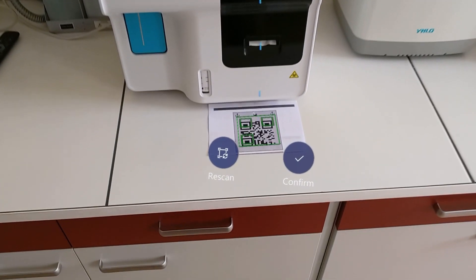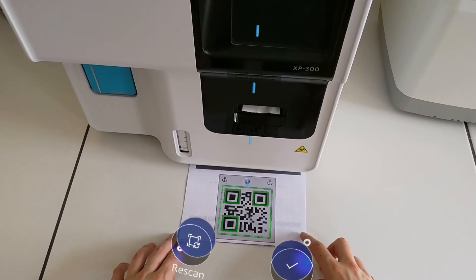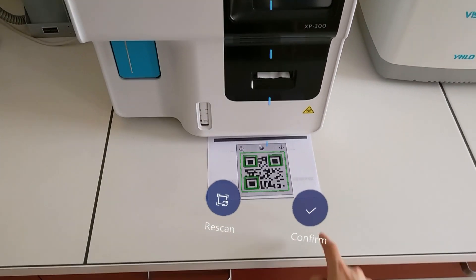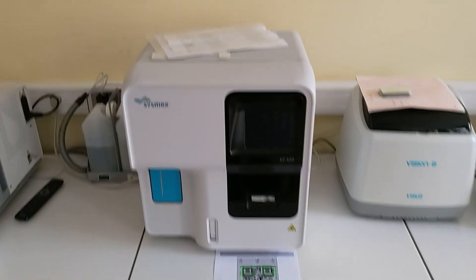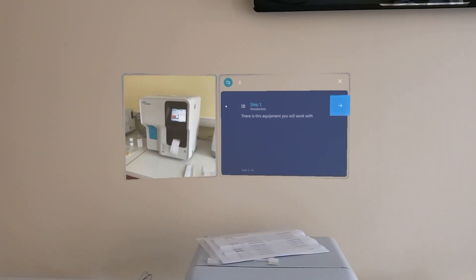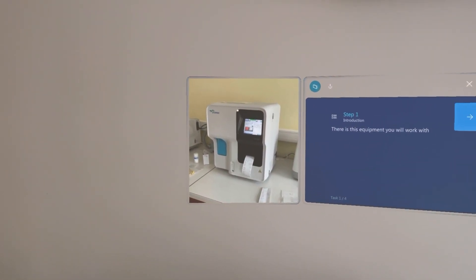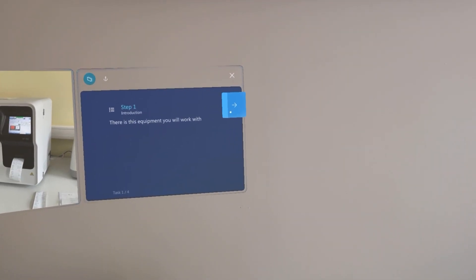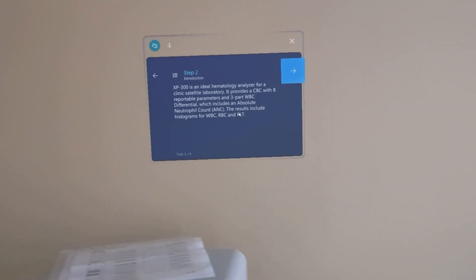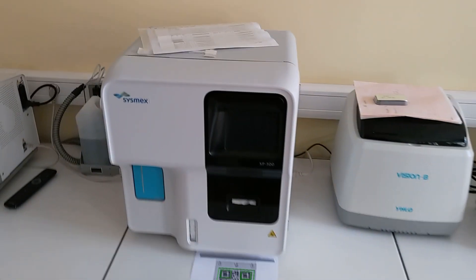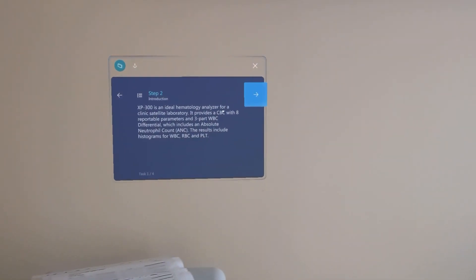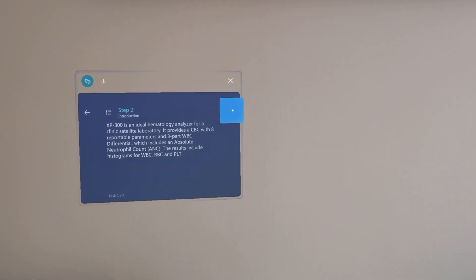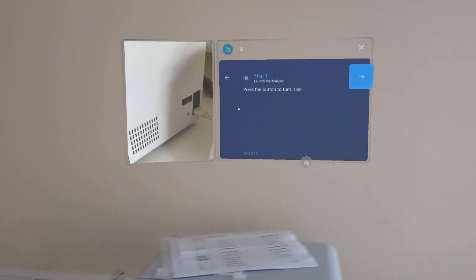Hello, this guide is intended to familiarize you with the operation of the Sysmex XP300 analyzer. It is a hematology analyzer for clinic satellite laboratories. The results include histograms for WBC, RBC, and PLT.